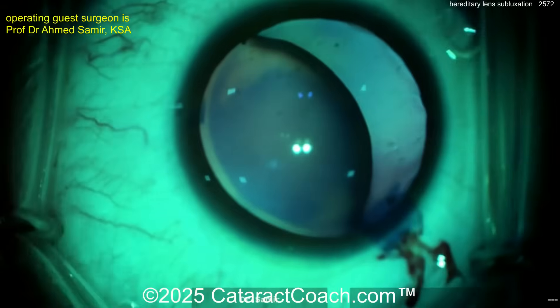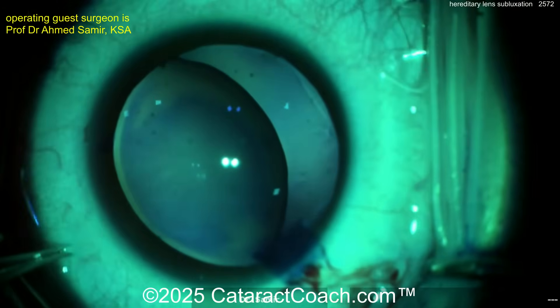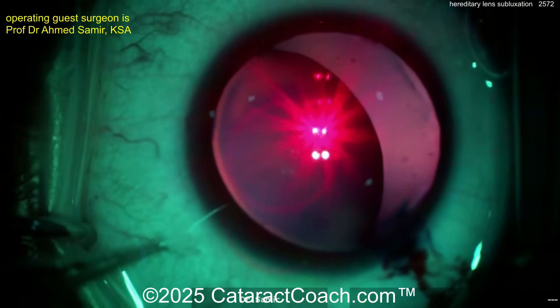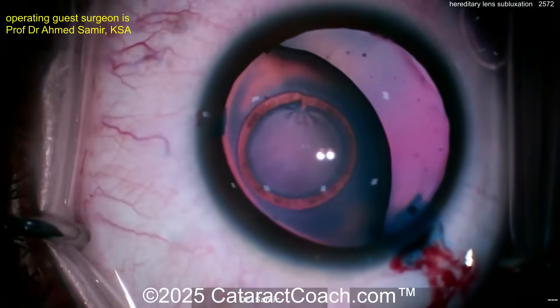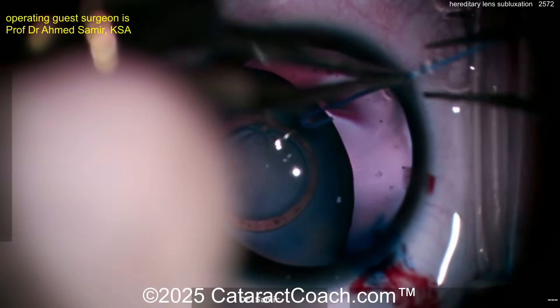Viscoelastic going inside the eye. There's that stained lens capsule. Why stain it? There's a laser filter, and here comes a laser device to create the capsulotomy. The tough part is that it's so de-centered — you really have to get right up against that pupil margin. That's a nice, reasonably small capsular opening.